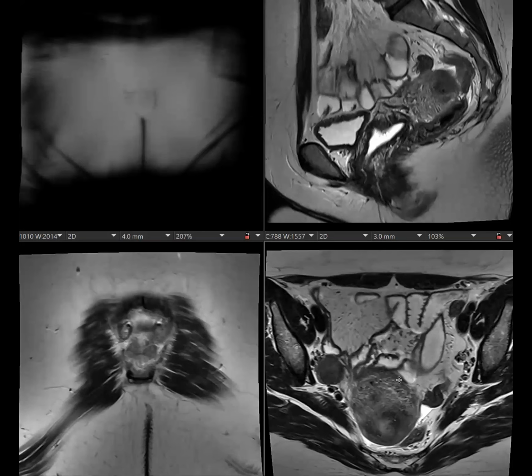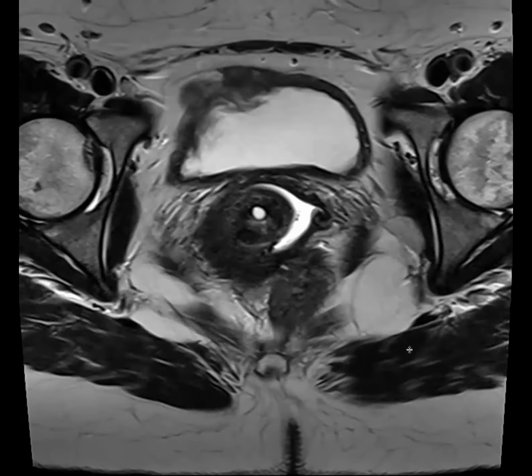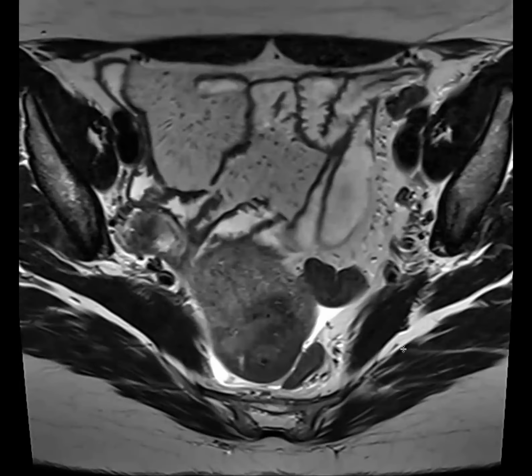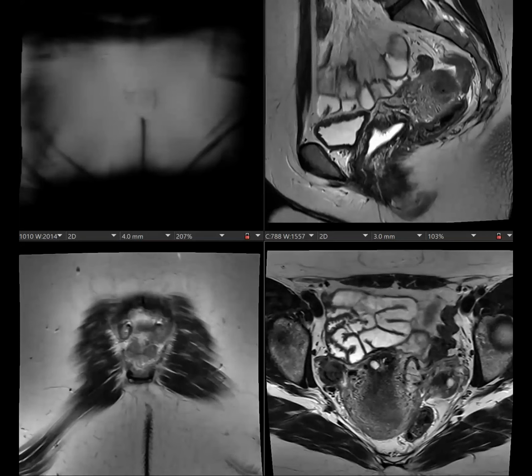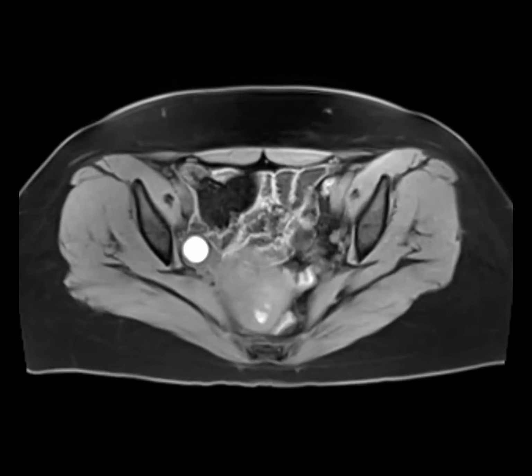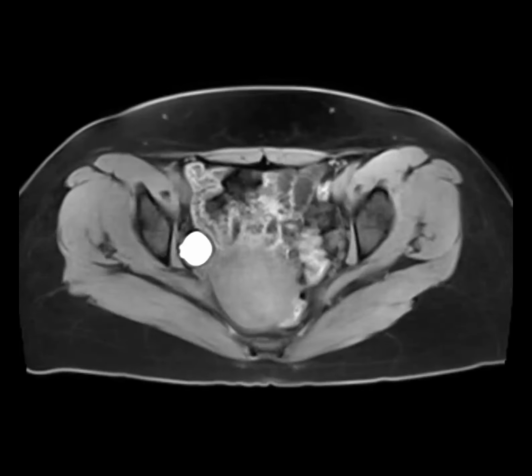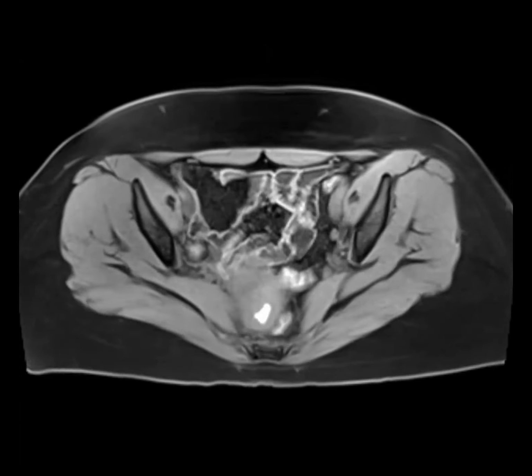Should I continue or are we going to switch out? This patient has pelvic pain. Okay, and then the T1 is, so there's an endometrioma on the right, this T1 hyperintense finding. I want you to focus on this.